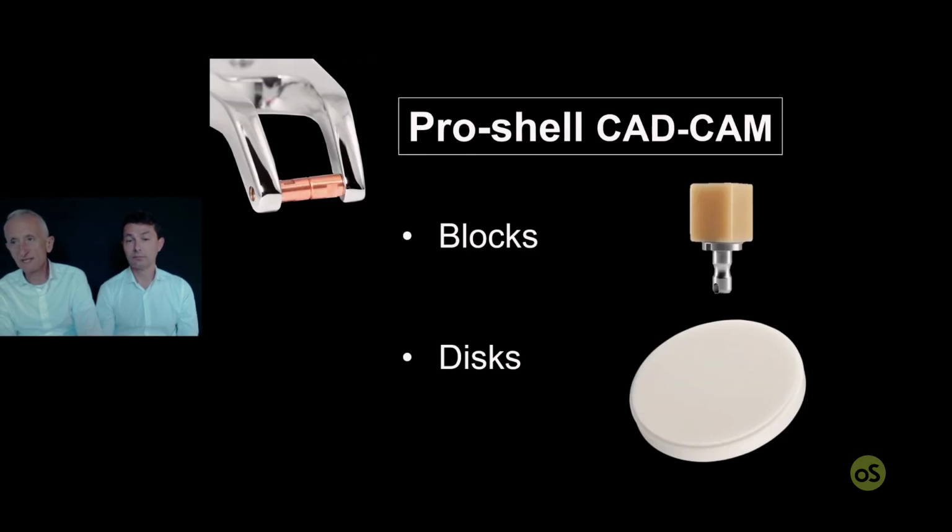Okay, so we've seen the CAD/CAM shell and the 3D printed shell, and basically these are used with the indirect approach because they are both time-consuming. I understand. Yes. Okay, so obviously everyone is welcome to use this concept also with a direct approach. This requires a little bit, not a little bit, a couple of hours more for a bridge. So that is a clinical decision, okay?